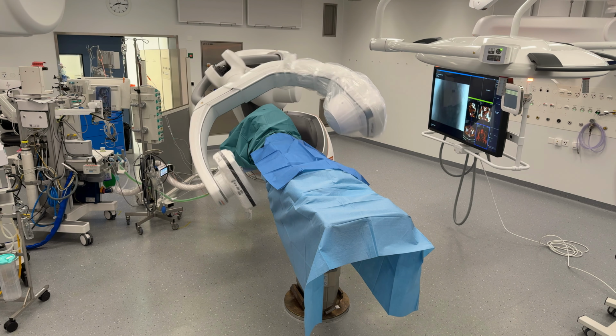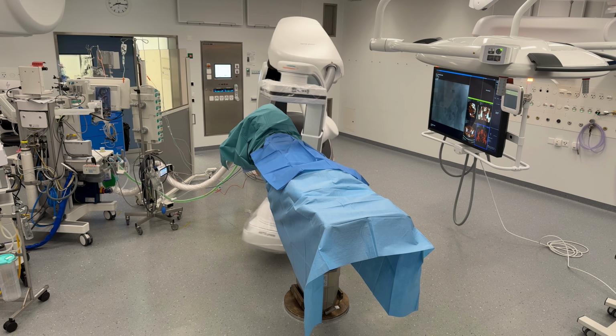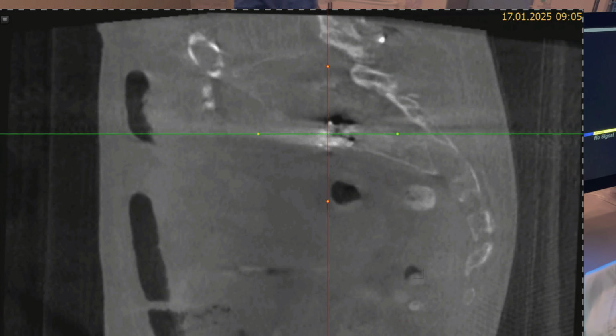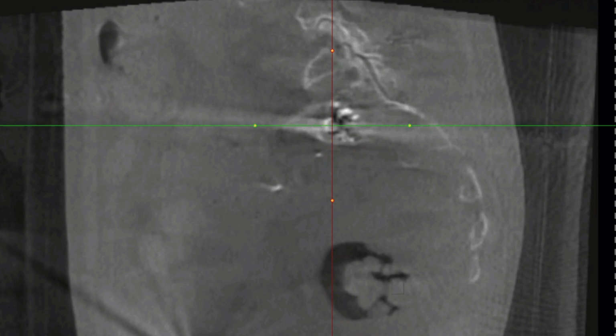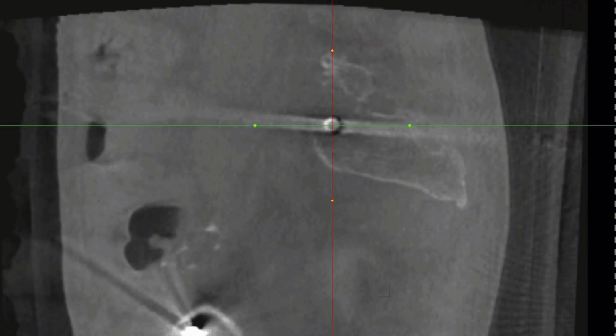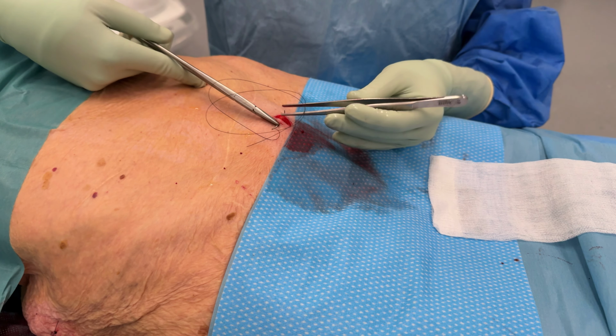At the end, a 3D scan is performed. The position of the screws are checked and if needed corrected directly in the same surgery. Wounds are rinsed and closed with single stitches. The patients are mobilized with full weight bearing with the help of the nurses on the evening of the day of surgery. For standardized positioning and collision-free movement of the robot arm, we recommend floor markings for all mobile devices.